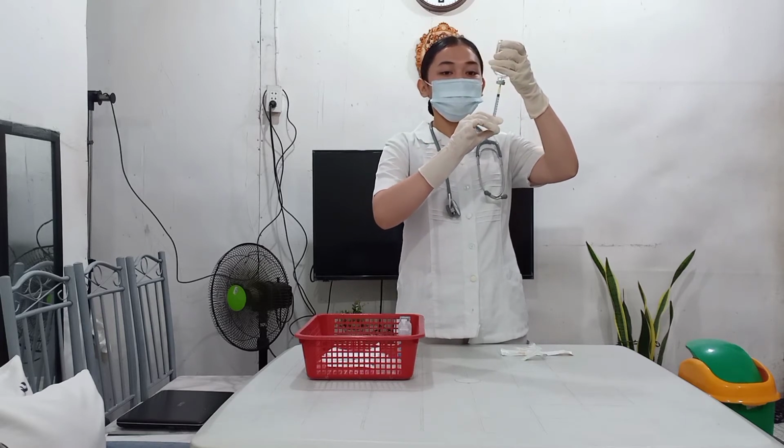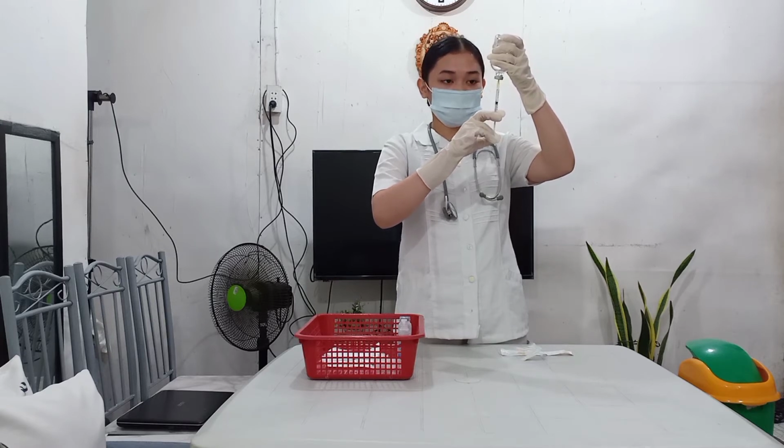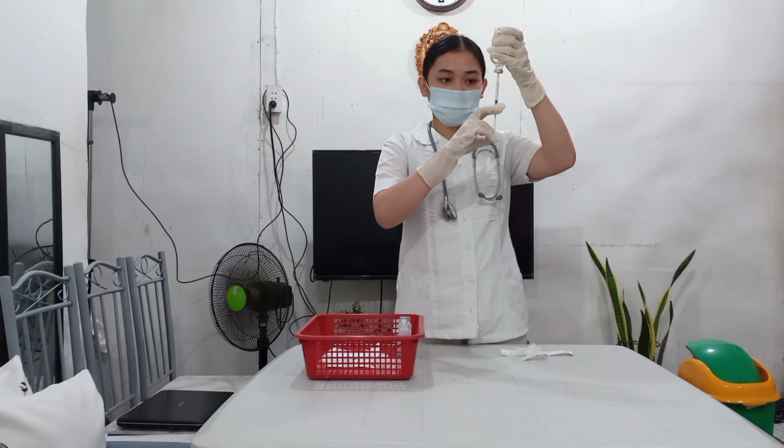Now I will withdraw the prescribed amount of medication, either A or B. A is to hold the vial down, moving the needle tip so that it is below the fluid level. Vertical position makes removal of air bubbles from the syringe easier. Or B, which is to invert the vial, ensuring the needle tip is below the fluid level and gradually withdraw the medication, which is what I am doing now.